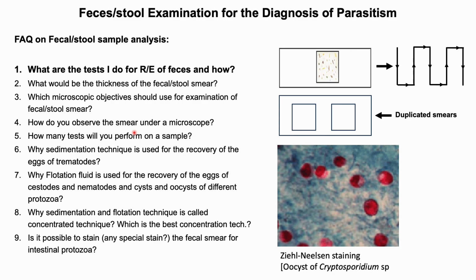For samples for research purposes, you have to do the same 3 tests, but at least 2 replicates for each of the samples, and each of the tests must be considered. Sometimes some of the reviewers of good journals ask to perform the test and verify the test result by 2 researchers or persons separately.